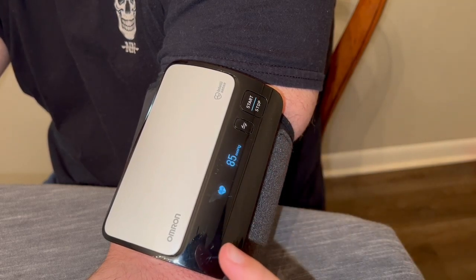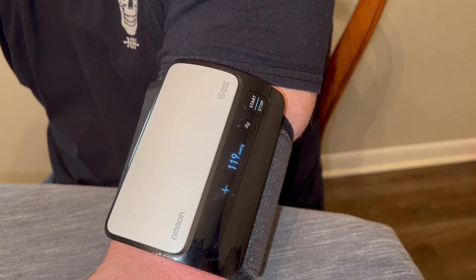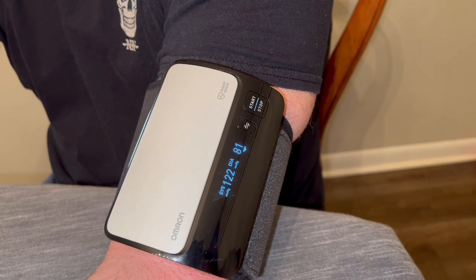As I mentioned before, it does sync with the Omron app and actually tracks his blood pressure. All you have to do is just hit the sync button once this actually gets a reading, and it will update and monitor and keep that history report.